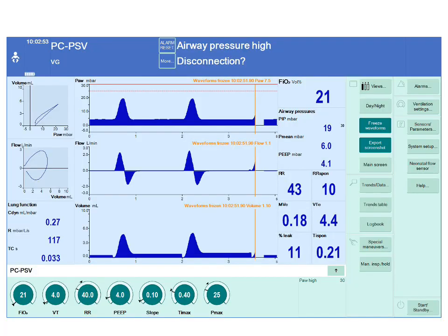I'm not going into the flow graphs or the leak, but I need to concentrate mainly on your minute ventilation. So for example, if we give a baby, which we're going to talk about later in the next few slides. Actually, I'm giving a few examples just to make sure that you can remember easily. So for example, this is the Draeger ventilator here. So you can see the minute volume, which is basically created.